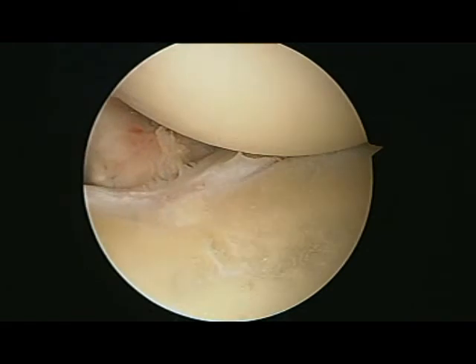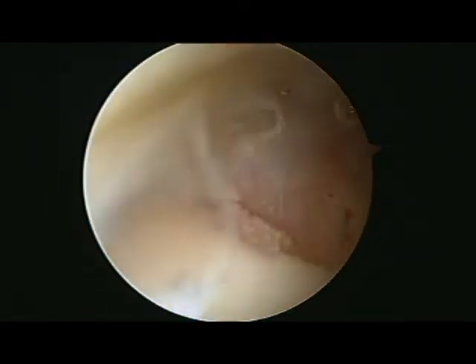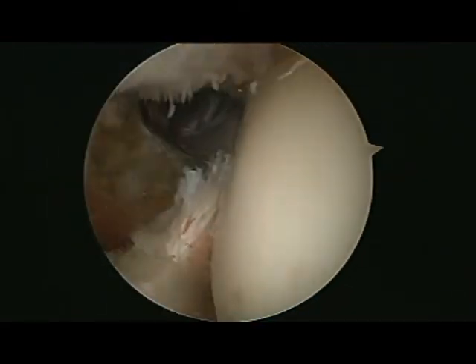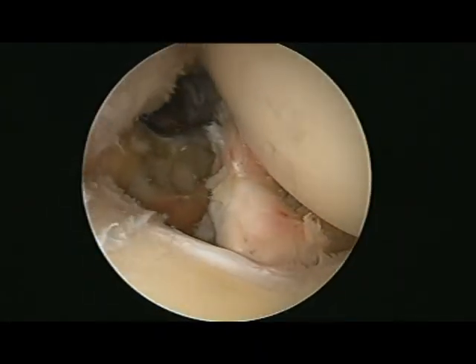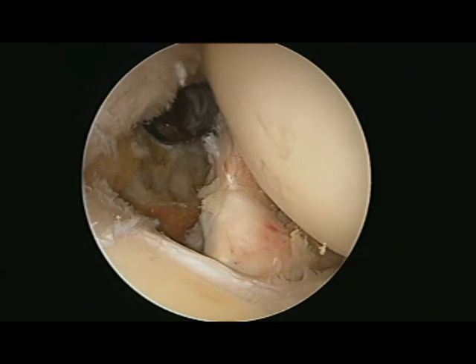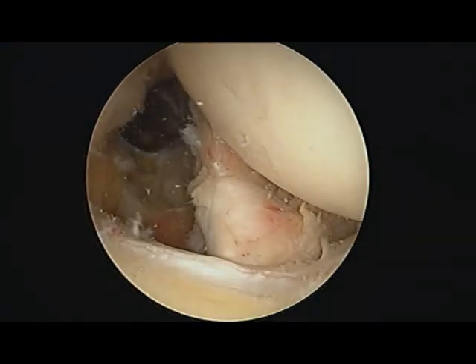There you go — that's the subscapularis, normal humeral head, normal infraspinatus, normal supraspinatus, and back to our subscapularis. As long as this patient follows the post-op protocol, she will get a great outcome with good pain relief and return of function. Thank you for your interest.